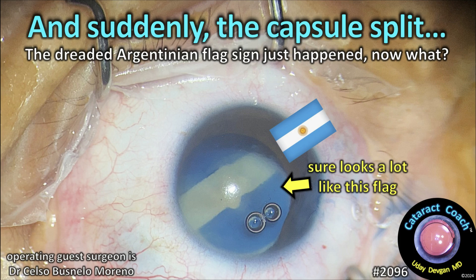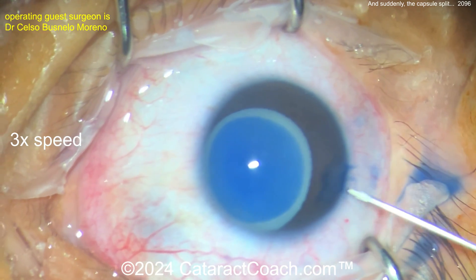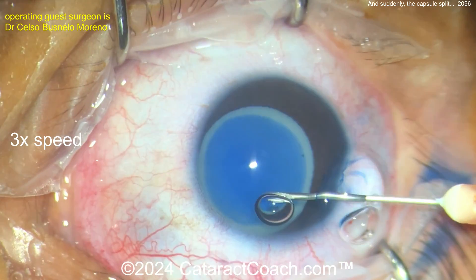From cataractcoach.com — suddenly the capsule split. The dreaded Argentinian flag sign just happened. Now what do you do? Tough case. We sped the video up at 3x speed, and now you can see staining of the anterior lens capsule has been done with the trypan blue dye, going in here with the needle, perhaps doing a needle decompression.